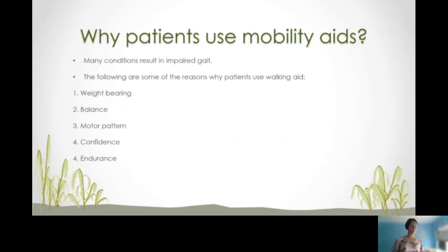Number 5, endurance. They will be able to walk further with the mobility aid than what they might do without one. And that is some of the reasons why patients use mobility aids.